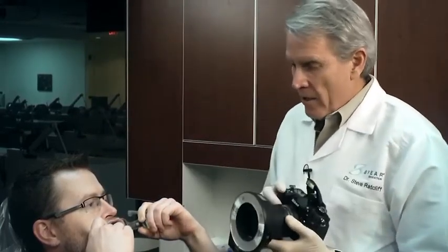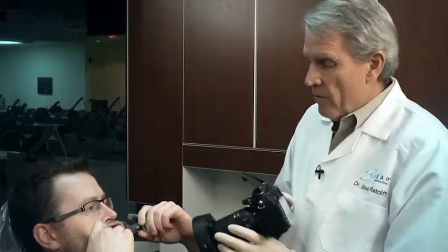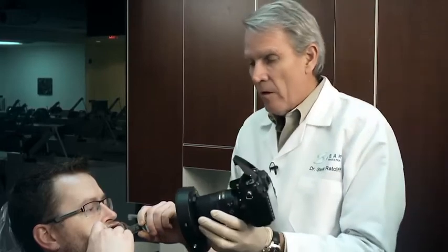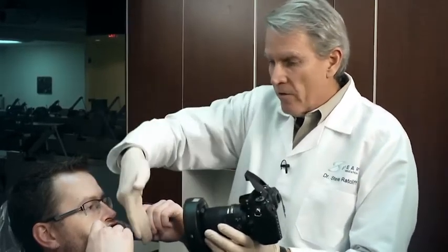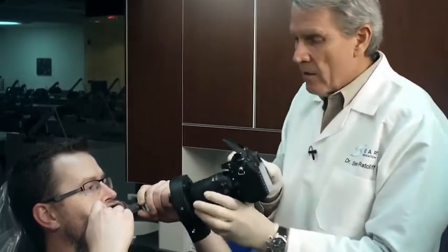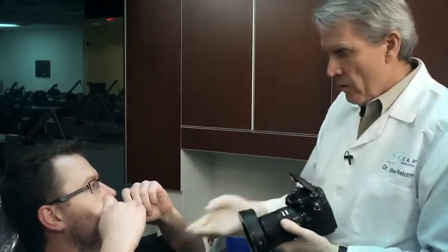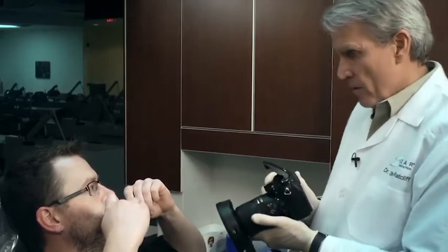I've got my camera set up, and we will talk about camera setups in another course. This one has already been set and is ready to go. When I'm taking this photograph, I want the lens of my camera to be perpendicular to the facial surface, to the plane of the facial surface of his front teeth. And I want to only see the teeth. As much as possible, I want to avoid the lips being in the picture. Scott, turn over towards me even more. Okay, and close just a little bit. Now open a tiny bit.